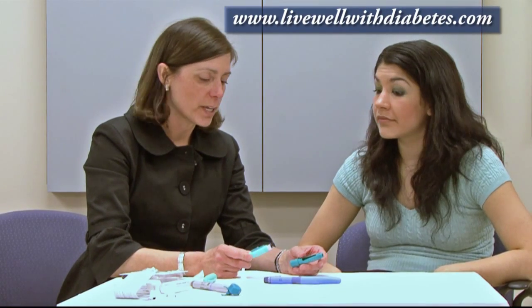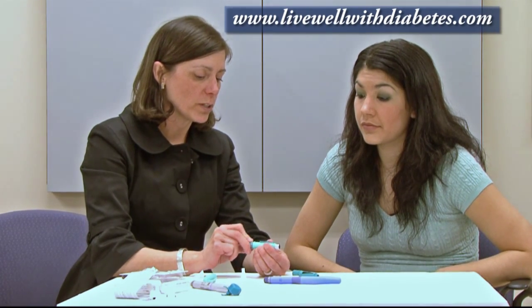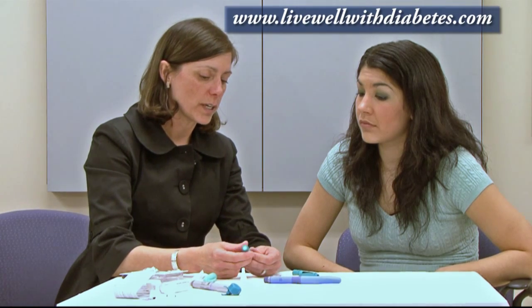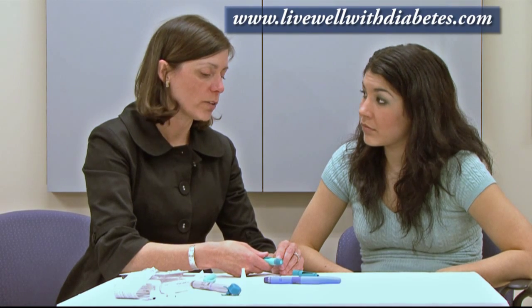As a reminder, here are some key points about this insulin pen. First, when you dial your dose up it moves by only one unit increments, and if you make a mistake you can't dial back — you have to start all over again. Second, when you inject the insulin and slide the button down, you'll see the triangle return to the solid line — at that point you must leave the needle in your tummy for 10 seconds.